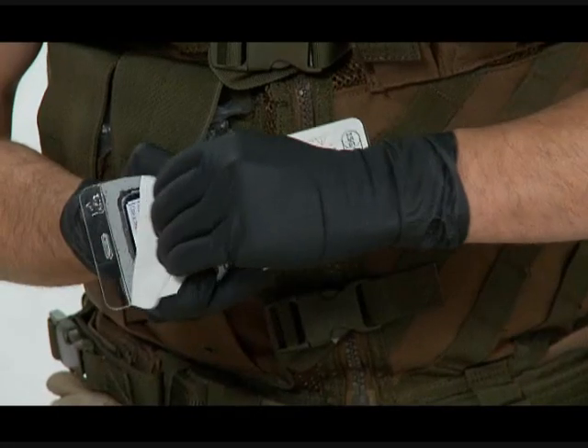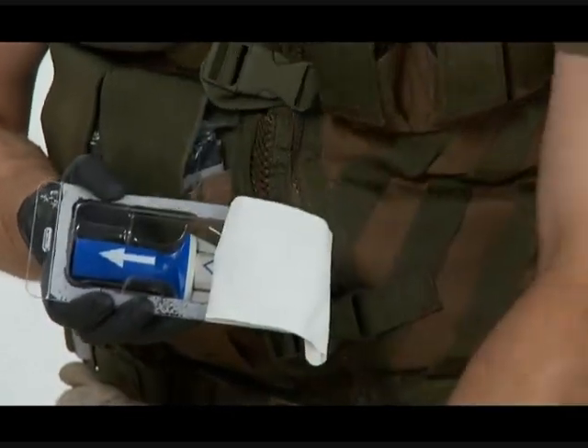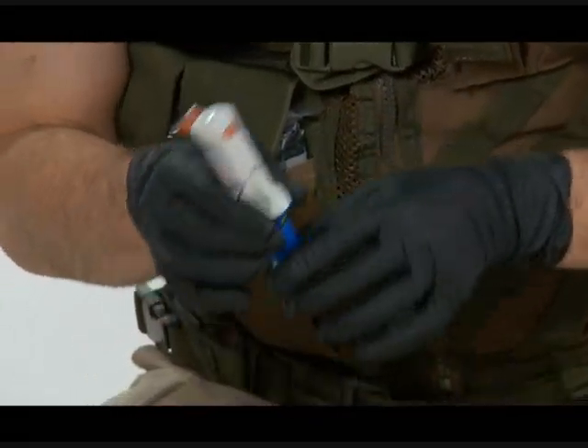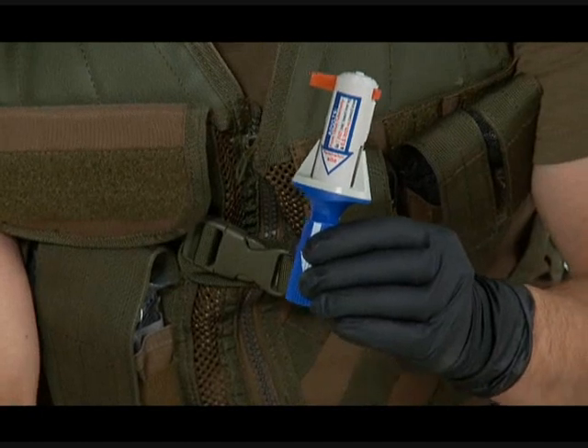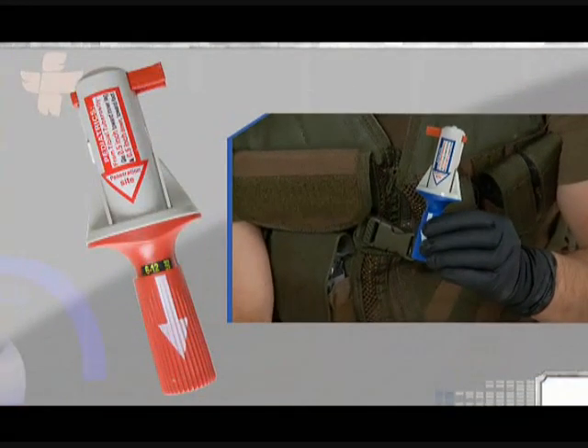The BIG does not require any assembly or any outside power source. Simply peel the packaging in the designated location and hold the BIG with your non-dominant hand by its blue or red barrel. The safety latch should never be removed before the BIG is positioned firmly on the designated anatomical site. Make sure that throughout the procedure, the BIG will be held by its red or blue barrel only.